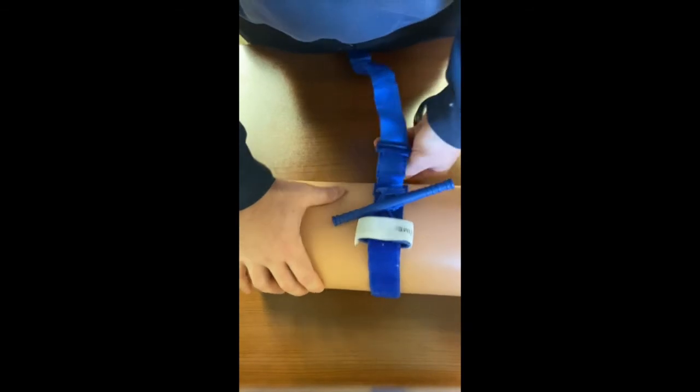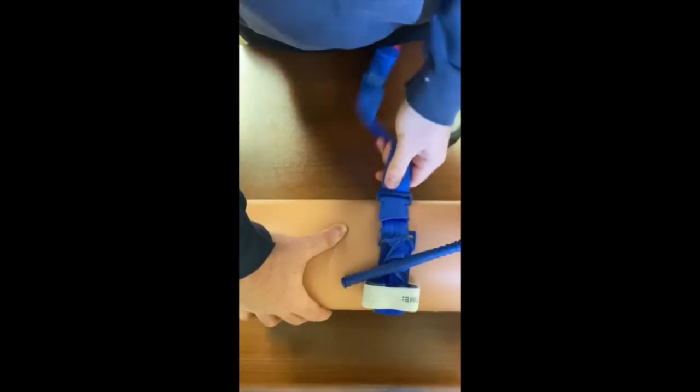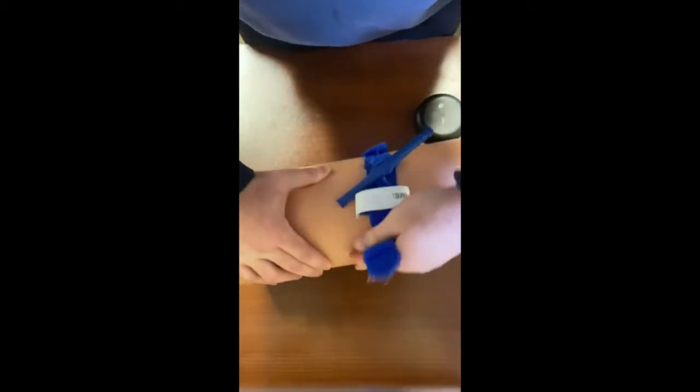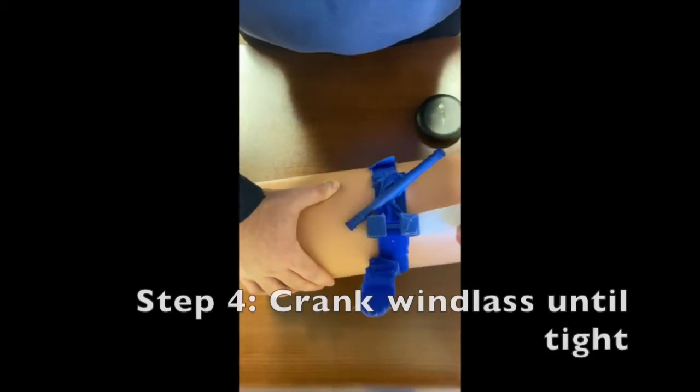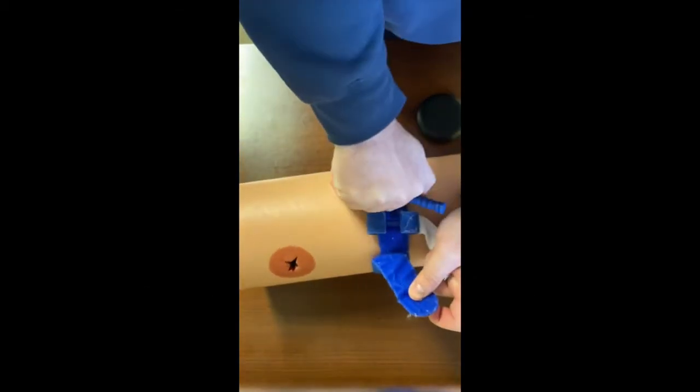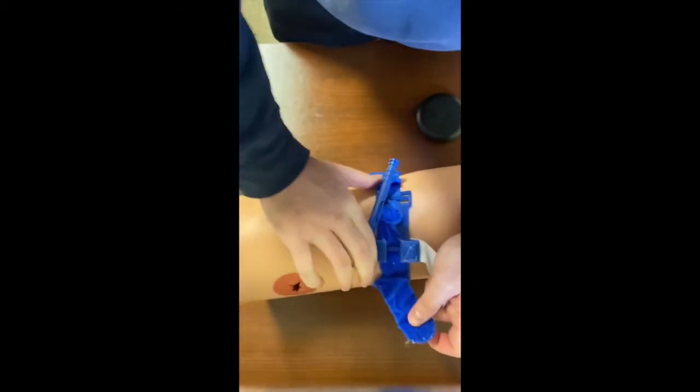So we're going to make sure we get this nice and tight by pulling down hard and as tight as possible right there. Loop that around, and now we're going to get into the windlass. So we call it cranking it down. You want to crank until you can't go any further.